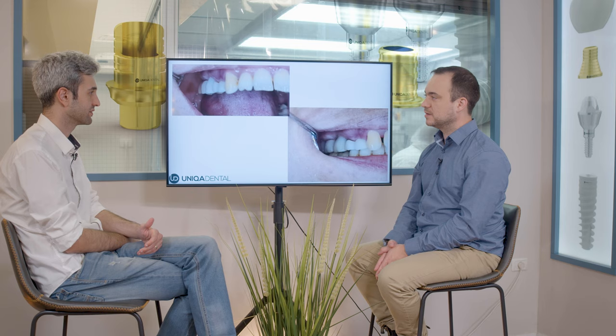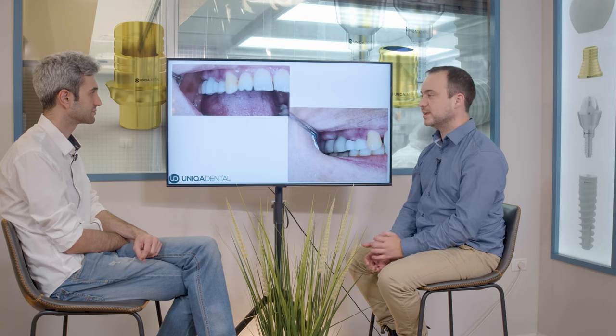So you made them smaller? Yes, the apico-occlusal part of the crown — the crown height is a little bit smaller — in order to take a little bit of pressure off those crowns. So for the next two to three months, less pressure will be on this implant and the probability that it will osseointegrate successfully is much higher.